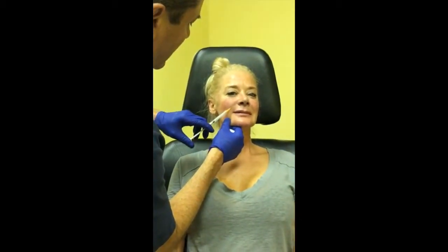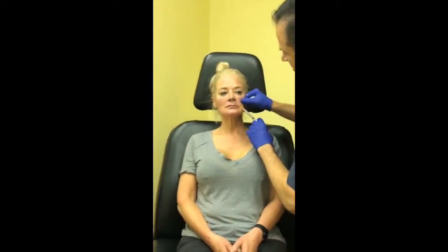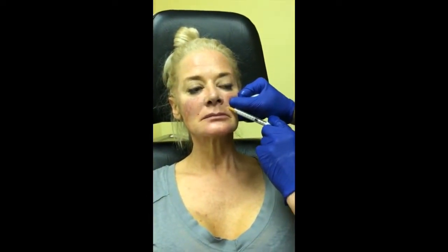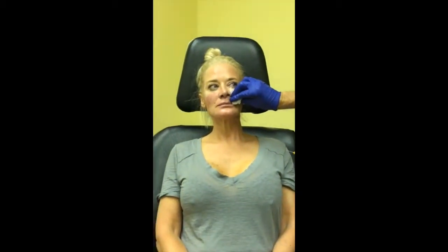Here I'm just fanning into this area a little bit. We want to soften — we don't want to completely eliminate this line because when you do that with filler it kind of looks unnatural. What we want to do is just decrease the depth and soften the transition from where it's high over here to where it's lower on the lip. We want to maintain the curves of the face but soften the transitions and the angles — no sharp transitions.